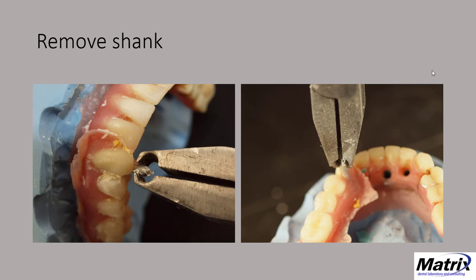When I'm removing the shank, or when I'm deflasking and finishing the case, it's a mess. As you can see, there is some flash.